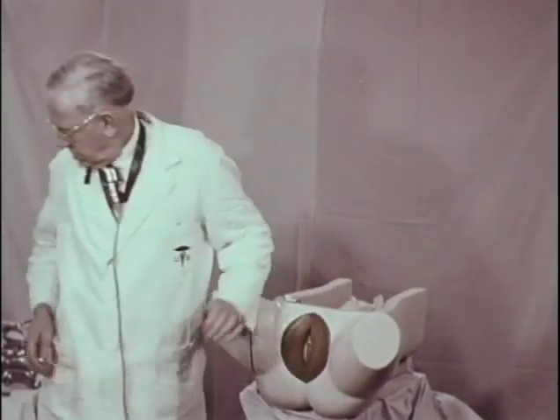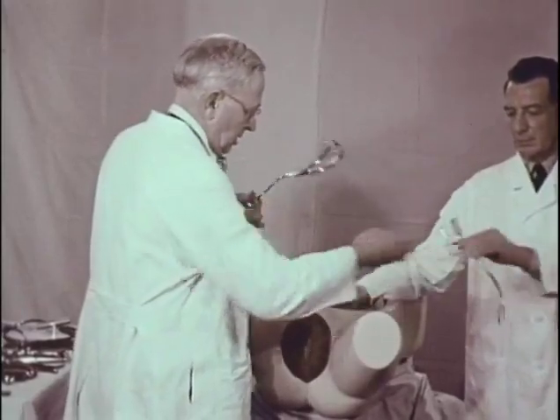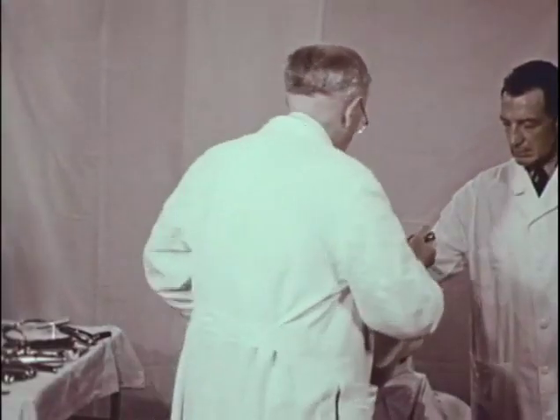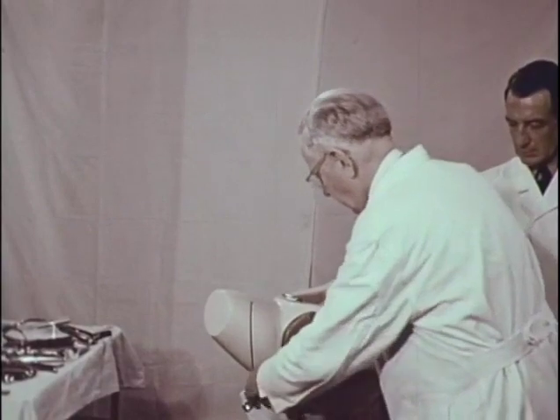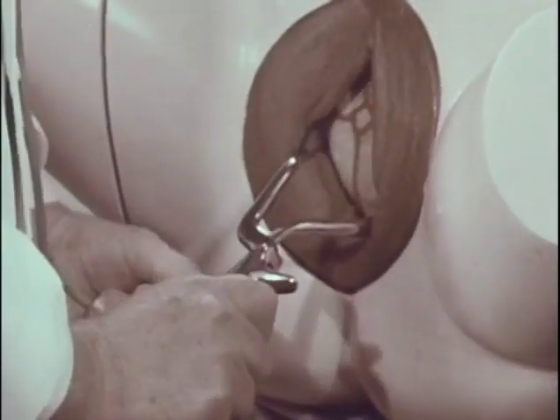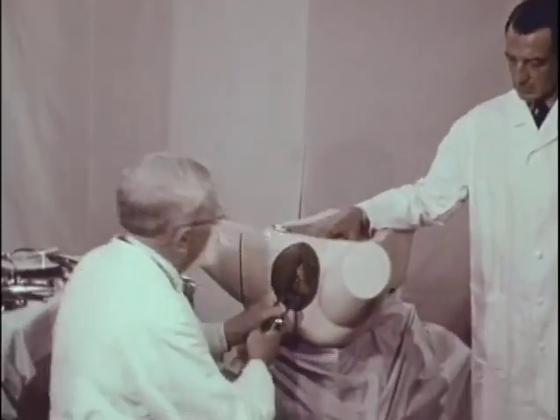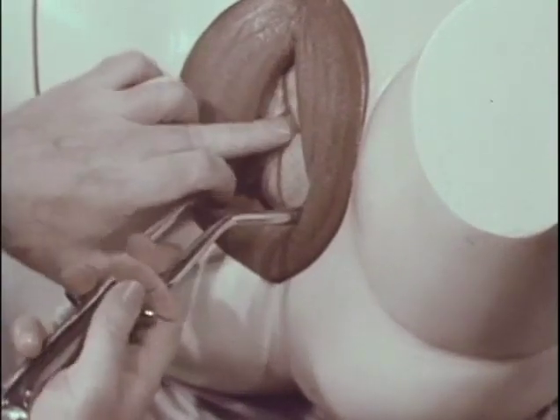a direct application of the Simpson type of forceps can be done, the left blade going to the left side, but to the right ear. The right blade to the right side, opposite the left ear. Depress the handles in order to have the shanks as close to the posterior fontanelle as possible, just prior to locking. Reseated, check our application, and proceed with traction.